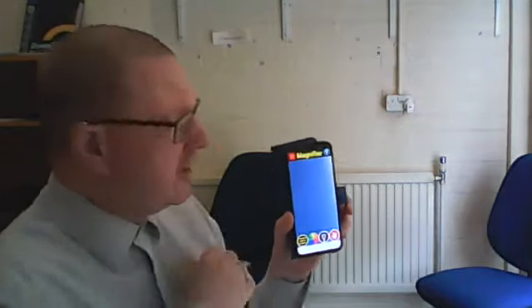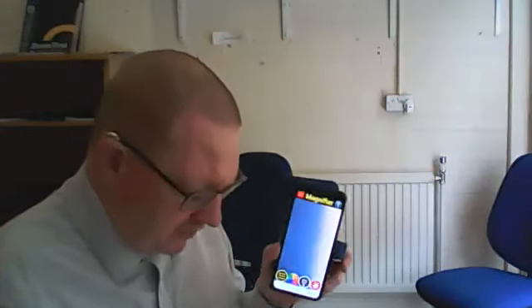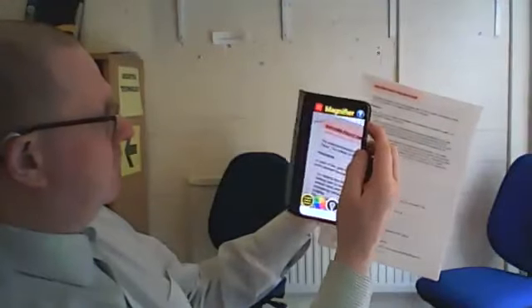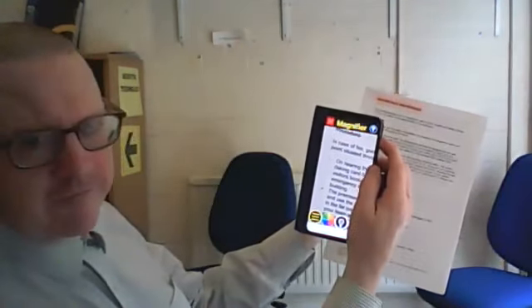So at this stage, it says to me, use the volume keys to increase or decrease magnification and touch the screen to focus. I'm just going to focus it by pointing at the piece of paper. And then I'm going to try to show you what this looks like using just my hands here. So I've got a piece of paper here with some text on it. And let's see if I can get it to get bigger. Zoom level 3. Zoom level 4. Zoom level 5. Can somebody confirm that that's actually changing?